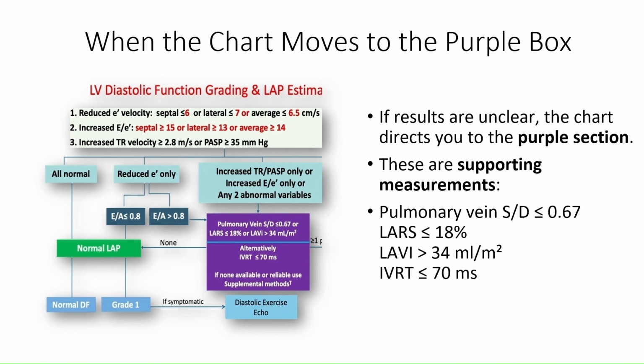LARS stands for left atrial reservoir strain. It measures how much the left atrium stretches during ventricular systole as it fills with blood. A value less than or equal to 18% indicates severely reduced atrial compliance and suggests elevated left ventricular filling pressure.